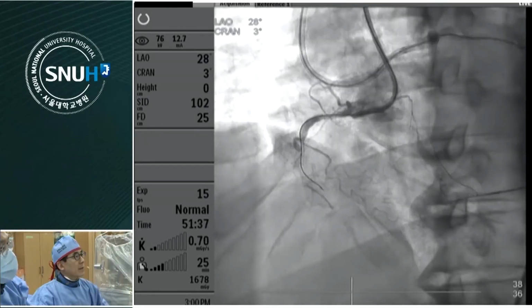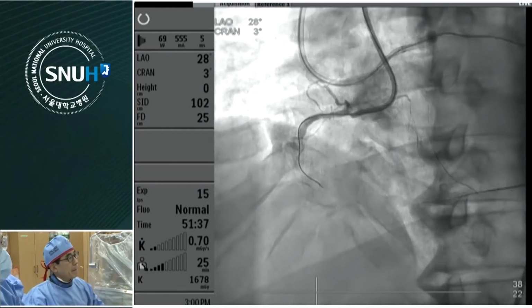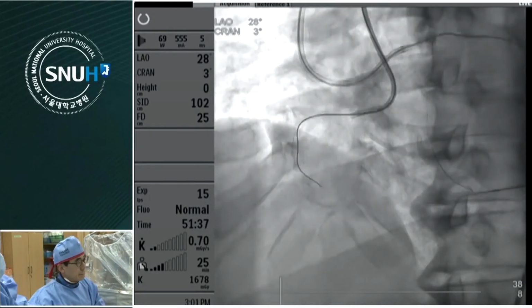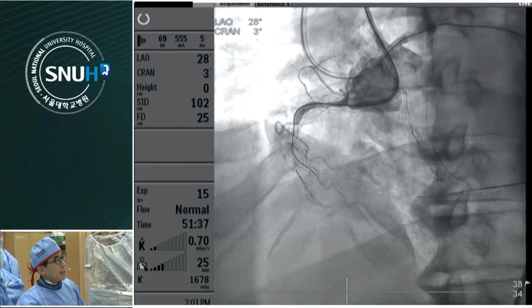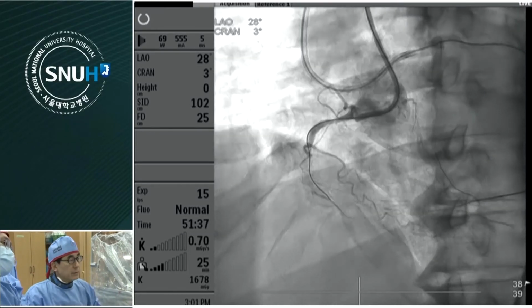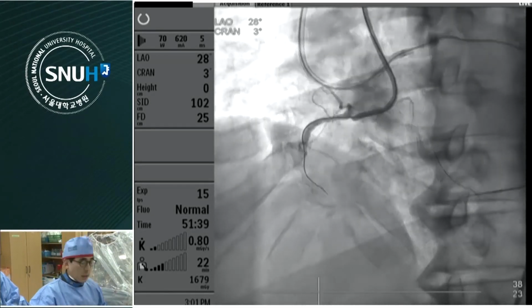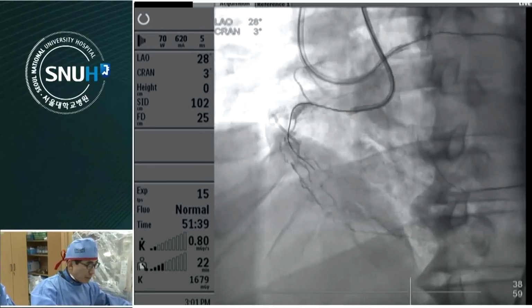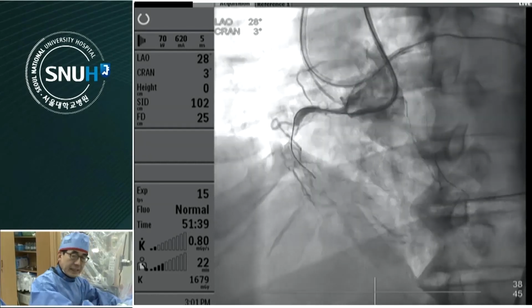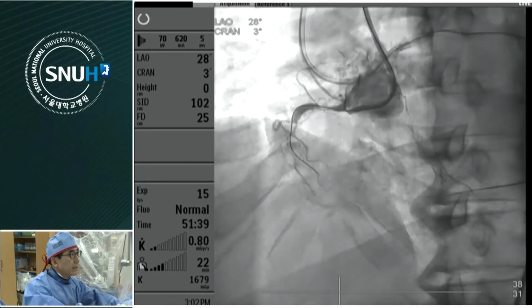Yes, there is a side branch at the ostium of the RCA. We can use it, or use a soft wire at the side branch at the proximal ostium. As your recommendation, we can use anchor ballooning, soft wire. Okay, the procedure should be kept on, and the final results will be presented at the end of the fourth live case, TAVI with Sapien 3. Okay, good luck.